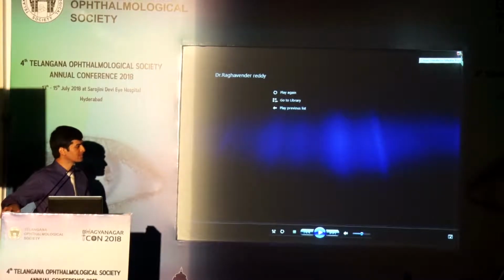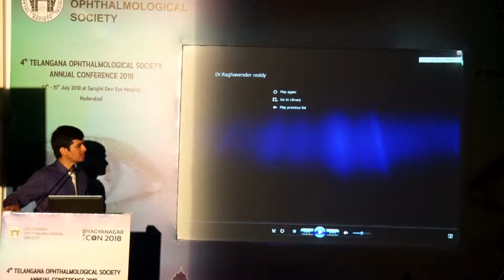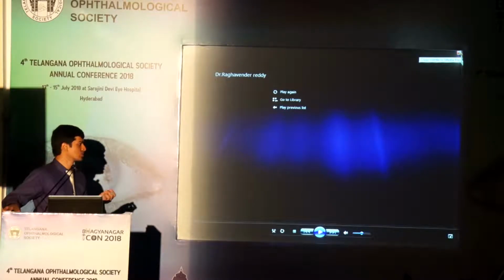It forms a blob, it is very stable. Yeah. Actually, there has been one case which was referred to our center where Yamane was done and then the IOL had completely tilted. So we had to remove it. But when we tried to remove it, the flanges were so hard that we had to cut the haptics and then place another IOL. So it's very stable in that way.